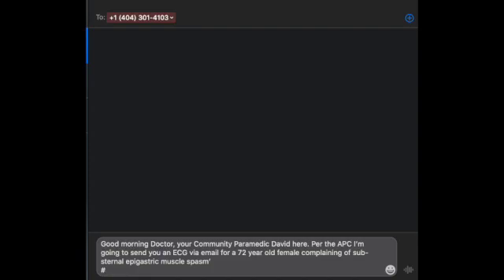Your community paramedic David here. Per the APC, I'm going to send you an ECG via email for a 72-year-old female complaining of substernal epigastric muscle spasm." If there is no reply to your text message within a few minutes, make a voice call to follow up and ensure the physician is expecting the ECG.